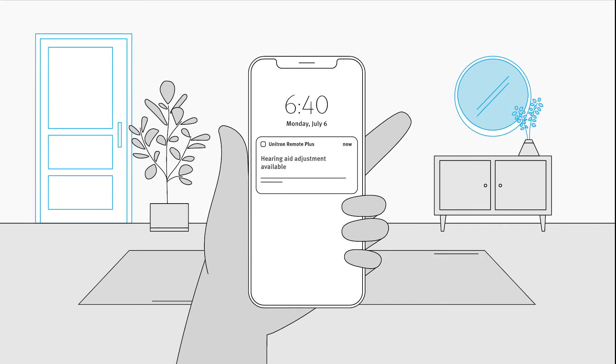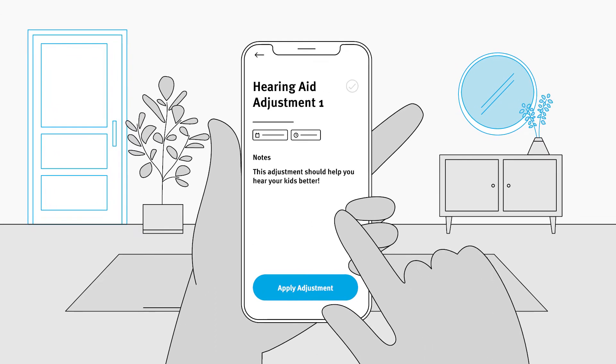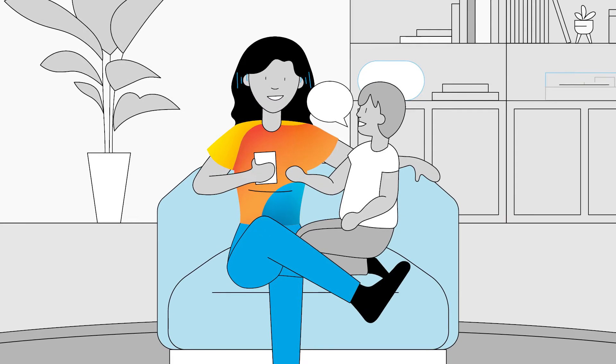You'll get a notification on your smartphone when your adjustment is available. Applying the adjustment is easy — open the Remote Plus app, navigate to the new adjustment, and tap to apply the changes. You'll be able to hear the difference right away.